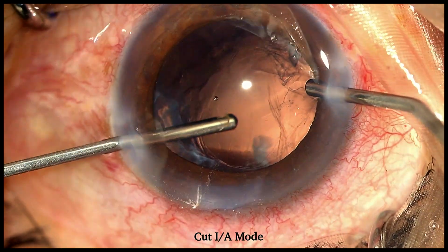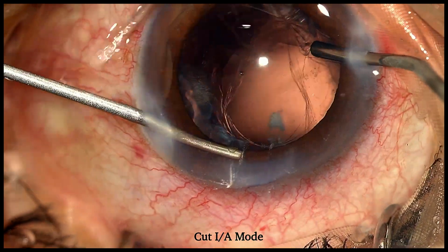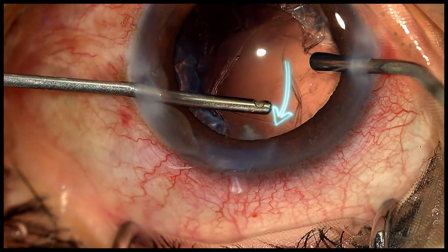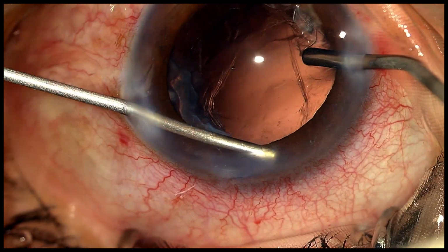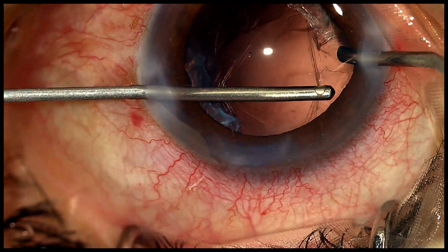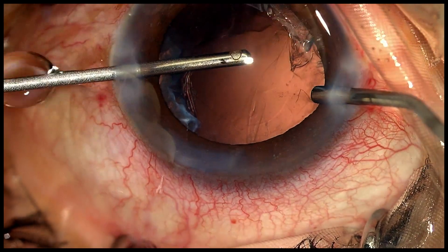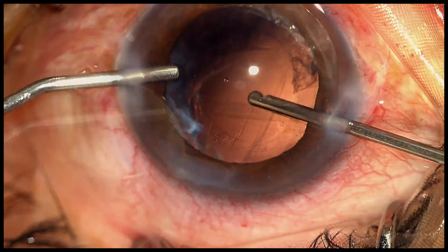The cut rate can be anywhere from 800 cuts per minute to even up to 2000 cuts per minute. The vacuum is limited at 150 millimeters of mercury. And as you do know now that strands of vitreous almost always prolapse in the area of the least resistance, that is typically towards the incisions, watch how I go and cut the strand which is prolapsing out through the main incision, and then the next one which tends to be prolapsing out towards the right paracentesis incision. A good guide is that sometimes you will see a notch in the PCR signifying that that is the area where the vitreous is prolapsing.